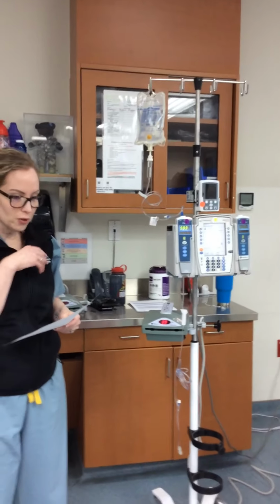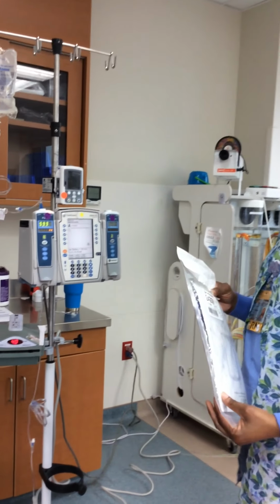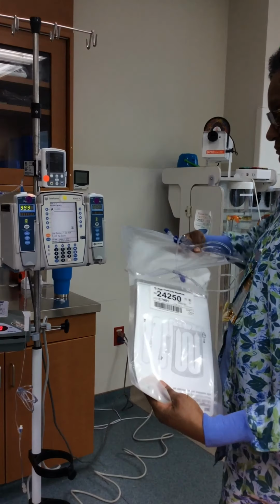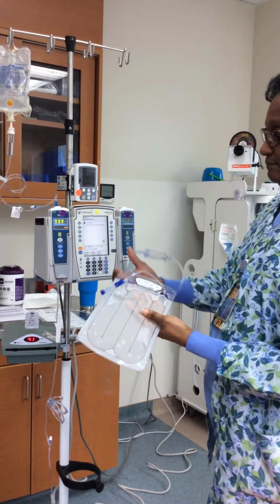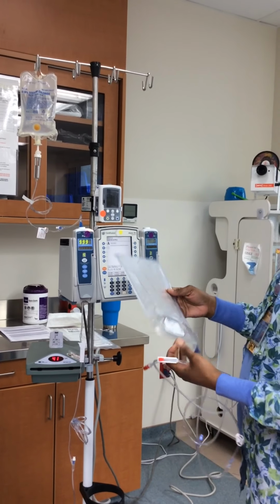I am going to verbally walk Keisha through how to get this set up. Okay, so we're going to start with inserting the cassette. These cassettes are going to be stocked in the swipe room. We'll do a par level of about 5 for now and see if that's enough. It does all come self-contained. You just need the warmer and the cassette to be able to use this.